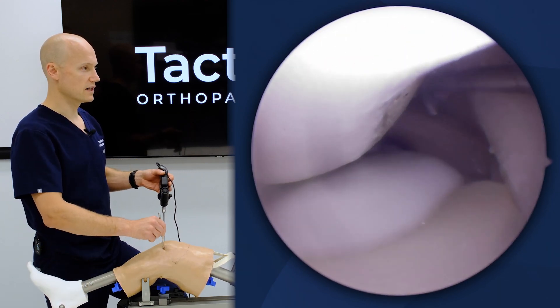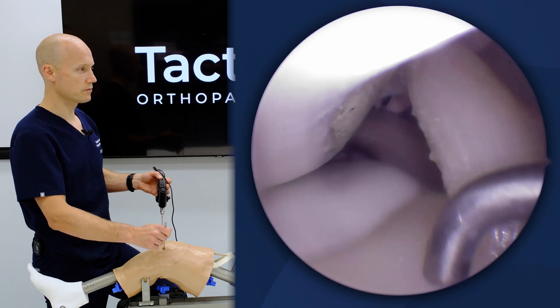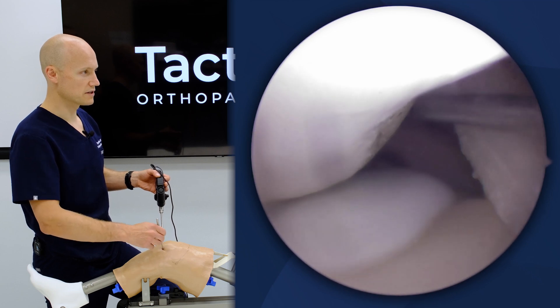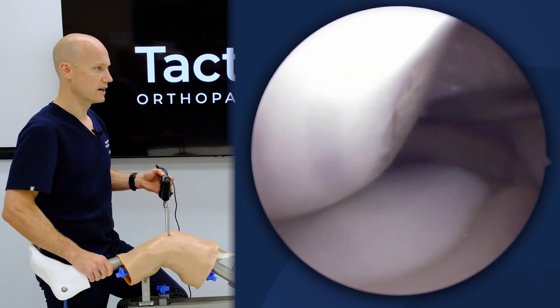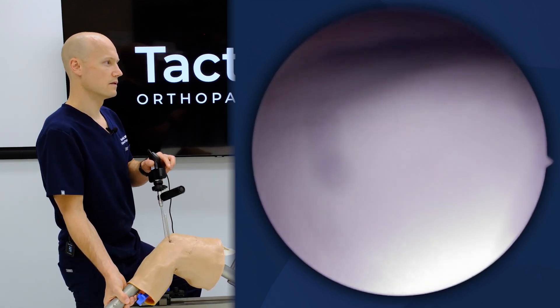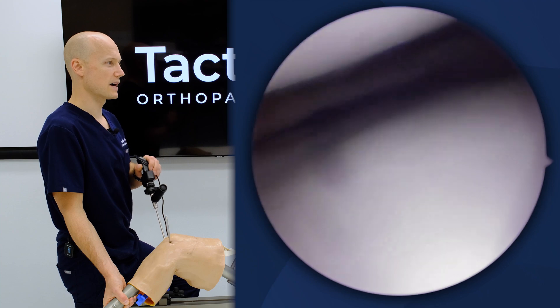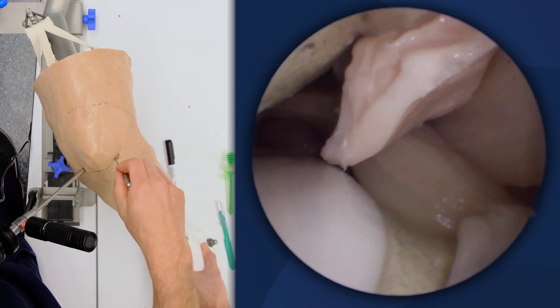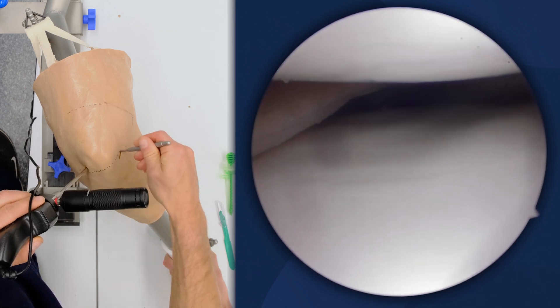Coming along, you can see the lateral attachment point and the anterior attachment point of the lateral aspect of the meniscus, and the shape of the lateral femoral condyle to the tibial plateau. With my probe in this area going to the figure four position, you can see access to the lateral compartment with the popliteus in the back — the popliteal hiatus and the lateral meniscus. You can see some of the fat coming in through the septum getting in the way of the lateral meniscus probing.